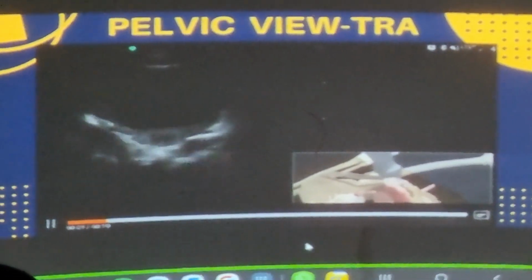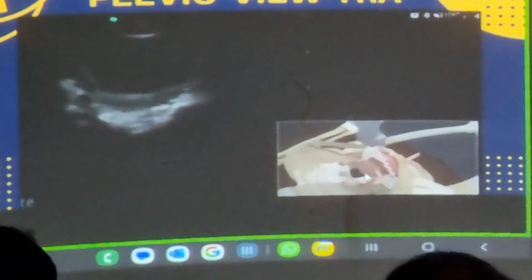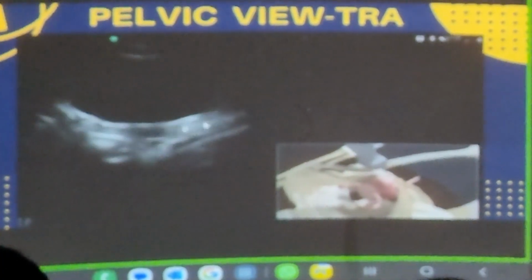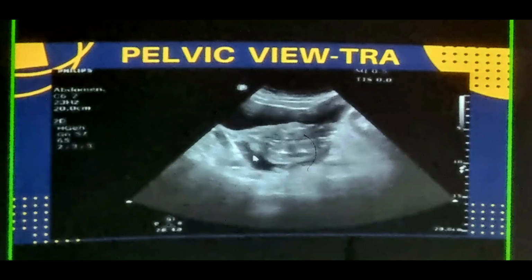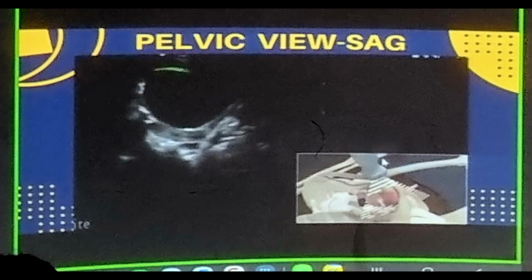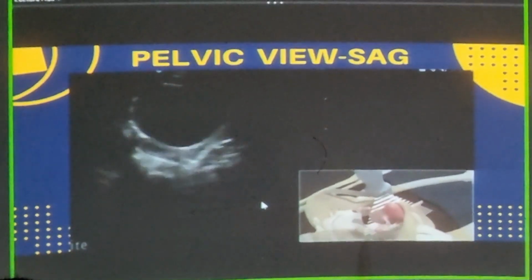Most of the people here don't understand the relevant anatomy of the bladder and the rest of the organs, and this is how it appears. Okay? So I have watched it again and again. It's very important to understand. Once the bladder is filled, the uterus is pushed much more posteriorly. Okay? I have to see free fluid. Any free fluid similar to this, jet black.